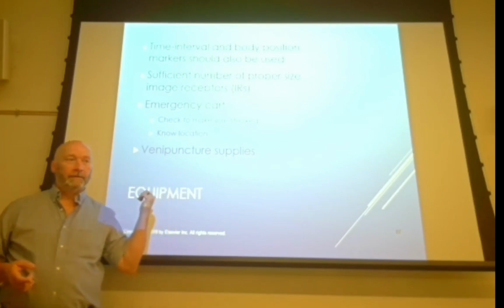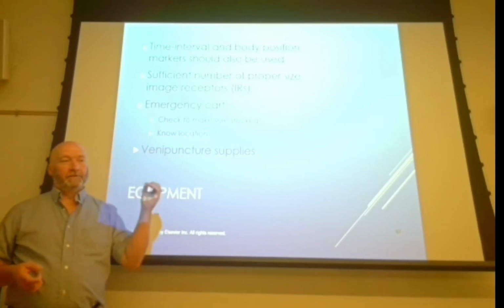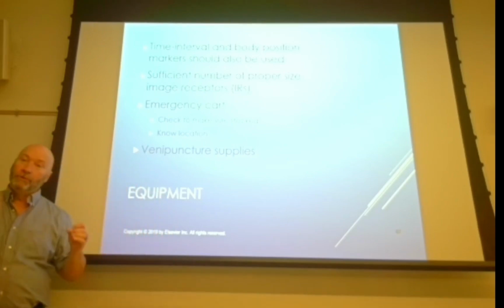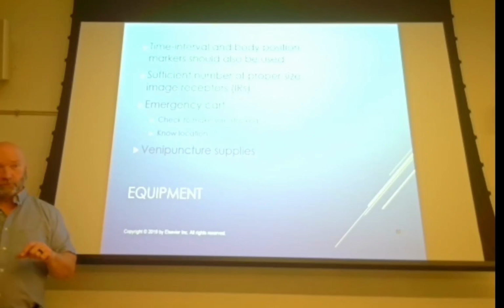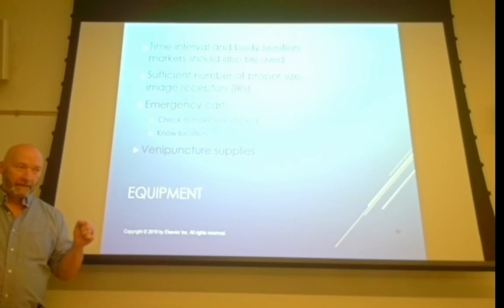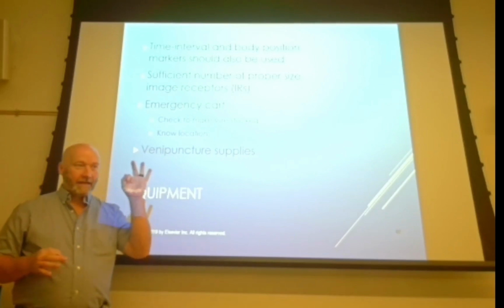Needles are the same way. An 18 gauge needle is a big fat needle that you don't want to get stuck with, but you do want to use that to poke into the port of the IV. What you want to get stuck with is something more like a 22 gauge. It's a little bitty tiny needle. So what that describes is the size of the bore.